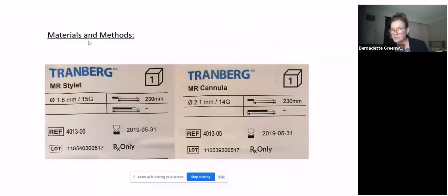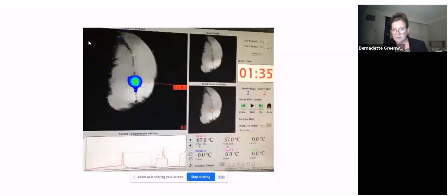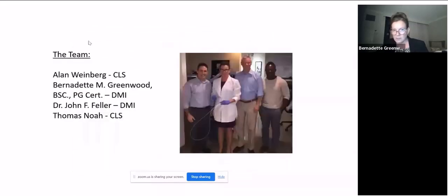There's a couple different kinds of fibers that we use. I showed you the cooled one a couple slides ago. This one is non-cooled. In other words, the fiber is naked. It doesn't go into a water-cooled sheath, and it's reserved for large treatments, big stuff, and also BPH treatment. You can see this little experiment I did with that fiber. It's very strong, very powerful. In only a minute and a half of treatment, I was able to achieve a little bigger than half a centimeter coagulation necrosis. And there's the team that did that little experiment.